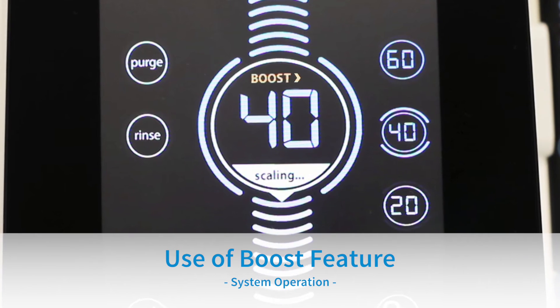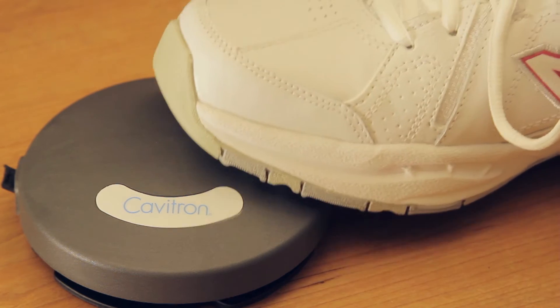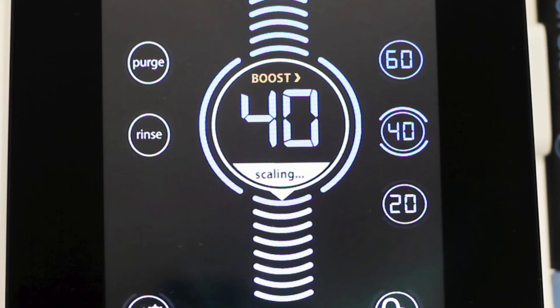Use of boost feature. The boost feature provides a temporary increase in ultrasonic scaling power for quick removal of tenacious calculus without actually touching the unit. Boost is activated by fully depressing the tap-on foot pedal to the second position. When boost is activated, the boost icon will illuminate on the power level bubble. Boost will remain on as long as the clinician has the foot pedal pressed all the way down. To deactivate boost, release the tap-on foot pedal to the first position.